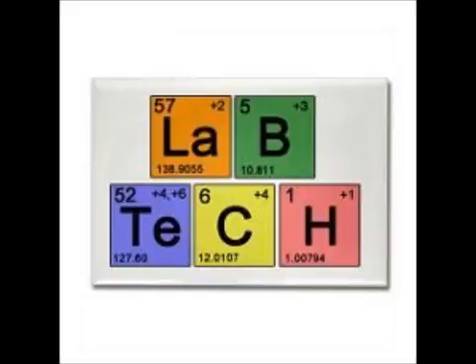Do you know what lipemic and icteric mean? What does your serum or plasma look like if it's lipemic? White. It's milky. If it's icteric, it can kind of be a brownish color sometimes, or a yellow green or a green. If you're on an optical density machine like the MLA 750, and it was that milky, the machine might not be able to detect a clot because it's already so hard to get light through it. The machines now are so good, you don't have to do a second analyzer.